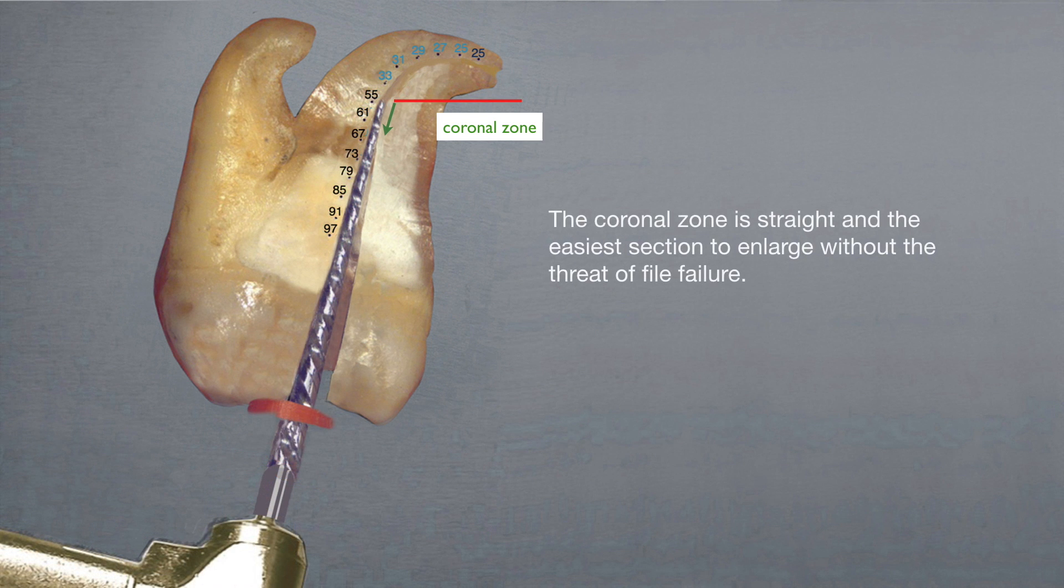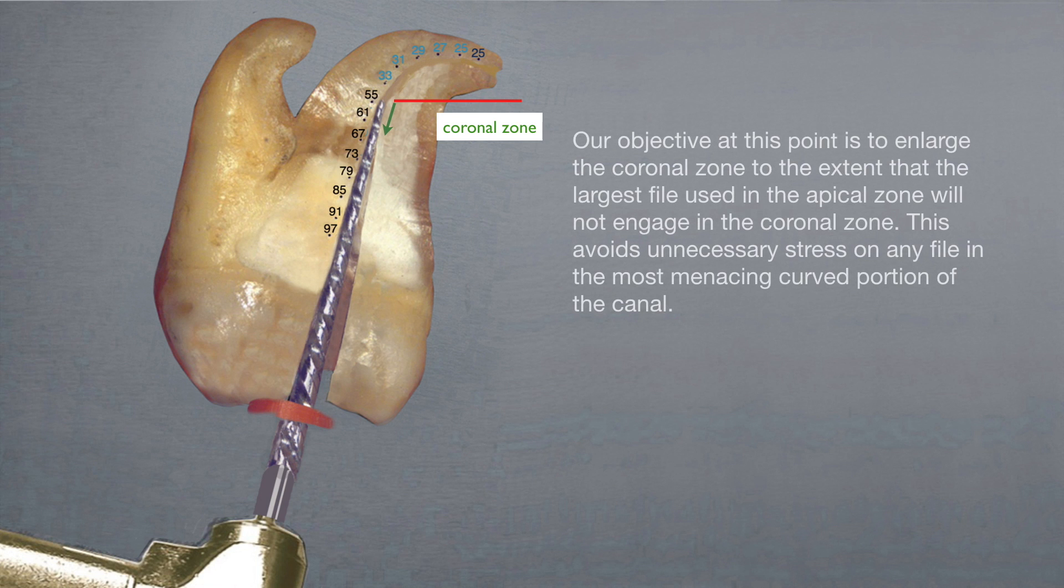The coronal zone is straight and the easiest section to enlarge without the threat of file failure. Our objective at this point is to enlarge the coronal zone to the extent that the largest file used in the apical zone will not engage in the coronal zone. This avoids unnecessary stress on any file in the most menacing curved portion of the canal.